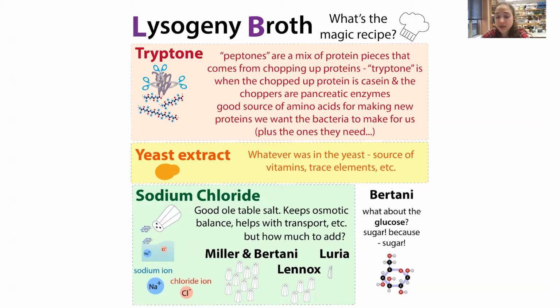We have yeast extract. This is basically whatever was in the yeast. We just break open the yeast and take what's in there. If it's good enough for the yeast, it's probably good enough for the bacteria. This is where you get your source of vitamins, trace elements, etc. Salt.